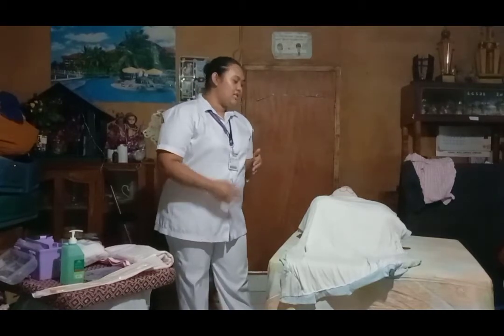Okay. So, ma'am, I understand that you are having difficulty urinating, and so your doctor, Dr. Ali Sonfardo, has ordered you to have a urinary catheter. So what I'm going to do is insert a tube through your urethra and connect it to your bladder.